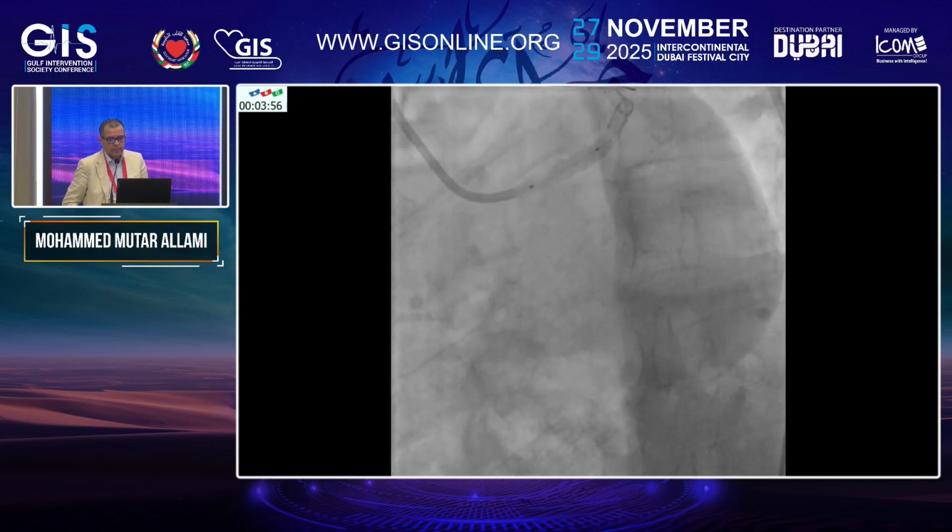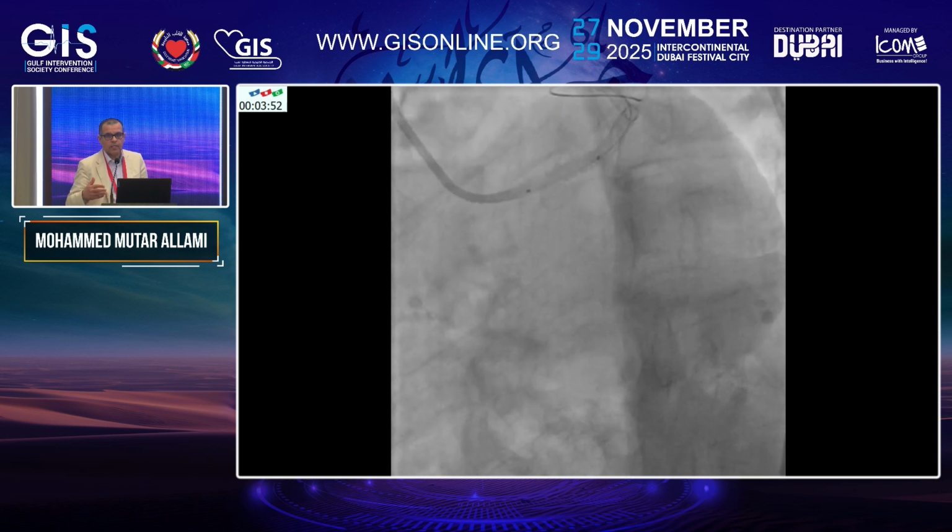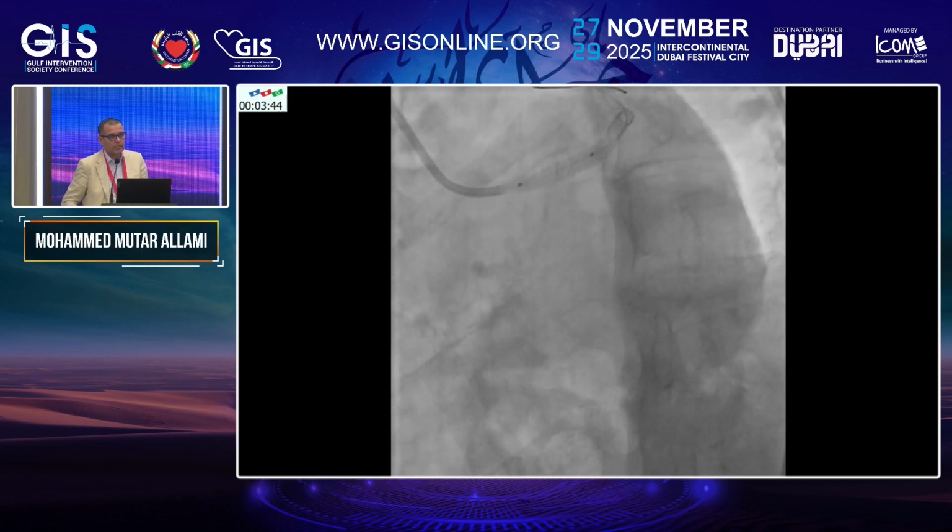So this is the optimization. Start with upgrading the balloon size: 2.5, 3.5, and 4.5, to widely open and create a new orifice to make future revascularization easier.